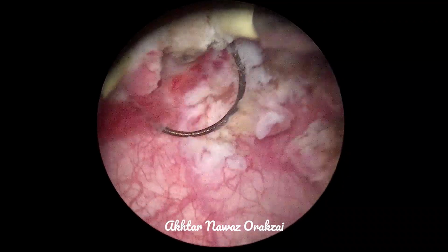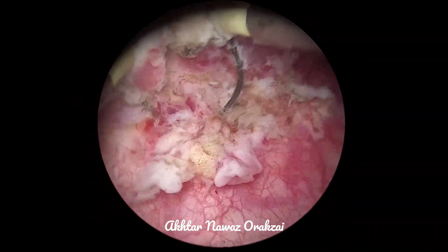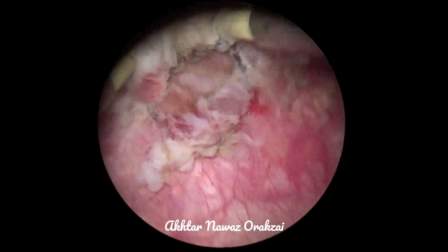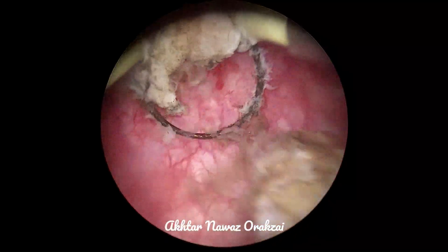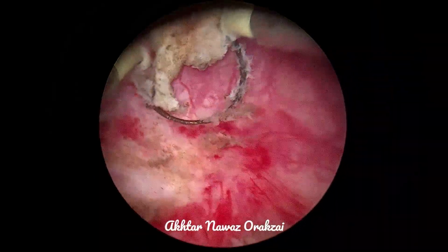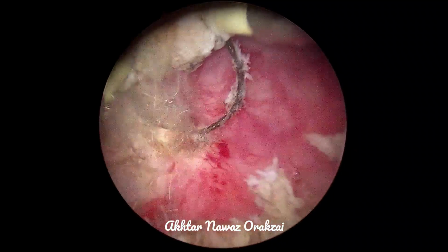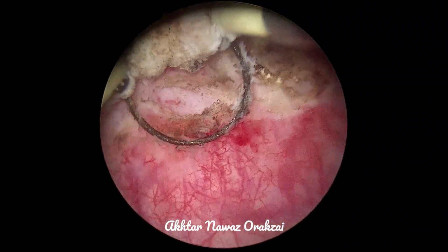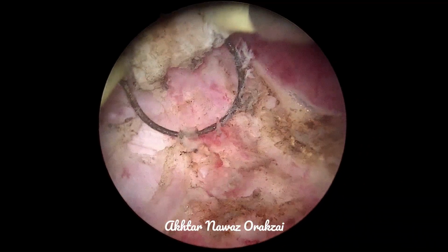Again, we are using pulses because a small mass can be easily excised or resected with the pulsing current rather than a big mass, which will require a more continuous application of the current. So the edges are coagulated.